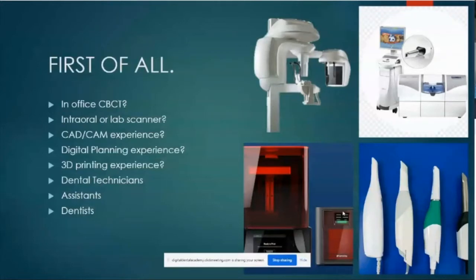What about the 3D printing? When you have your scan and you design it, then you're going to have to make it physical, right? So in order for you to make it physical, you need a 3D printer. So it's very important, and I think that this could be a really good subject for another webinar about 3D printing. There are a ton of very good people now talking about this.